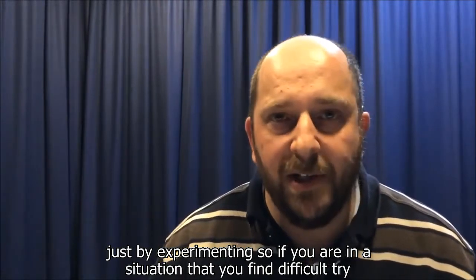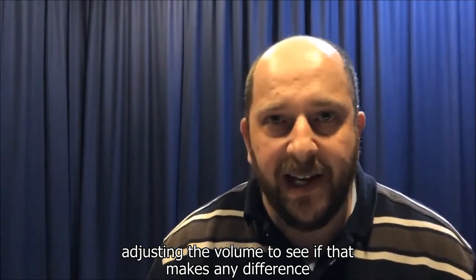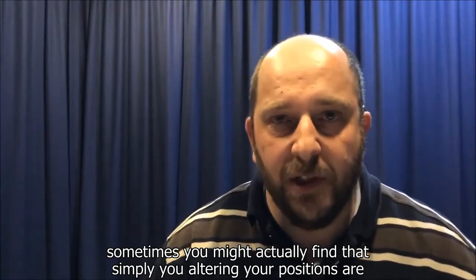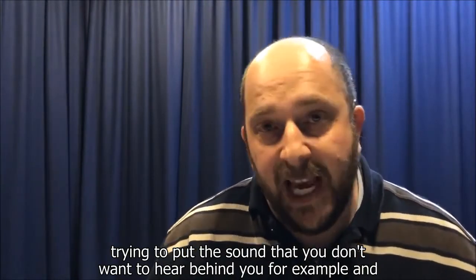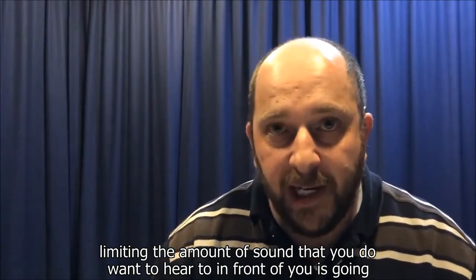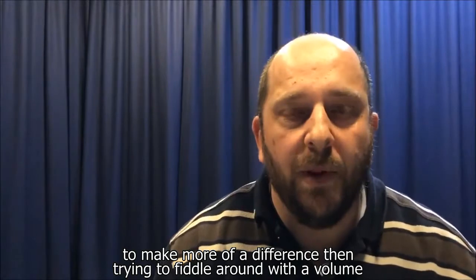So if you are in a situation that you find difficult, try adjusting the volume to see if that makes any difference. Sometimes you might find that simply altering your position, so trying to put the sound that you don't want to hear behind you, for example, and limiting the amount of sound that you do want to hear to in front of you, is going to make more of a difference than trying to fiddle around with a volume switch.